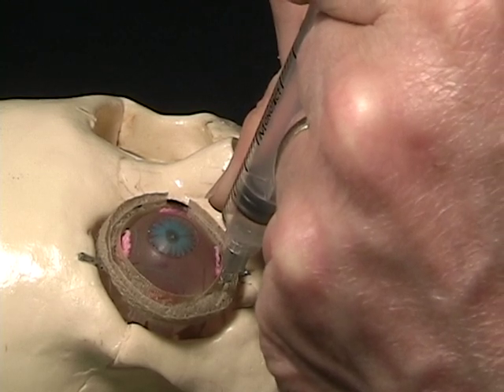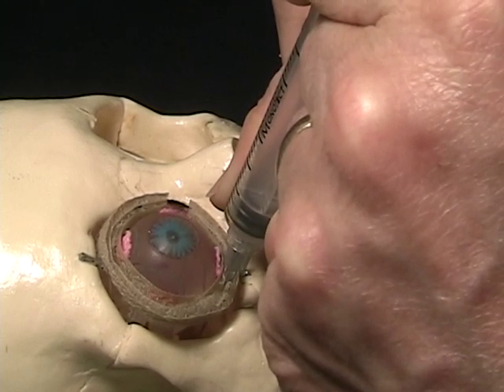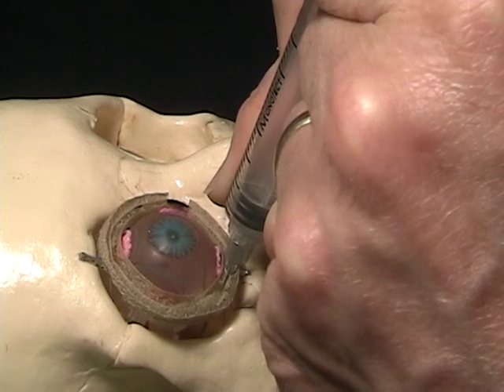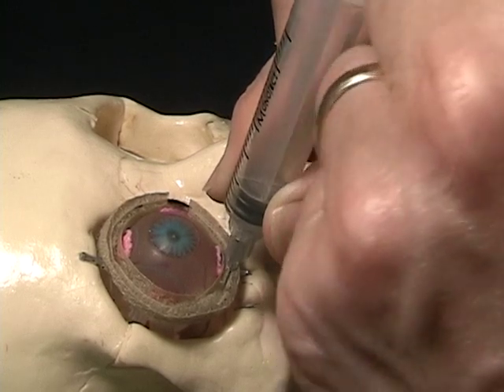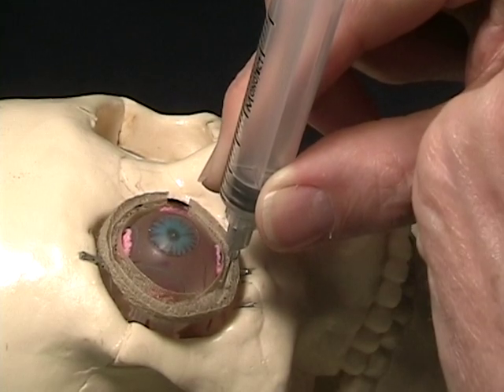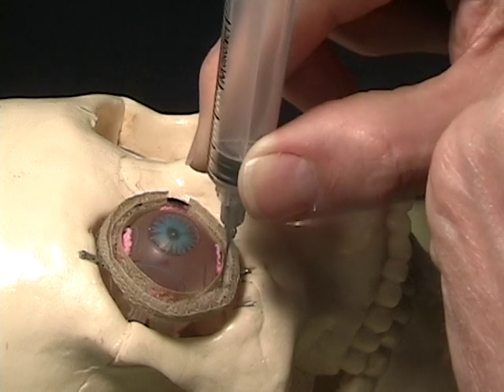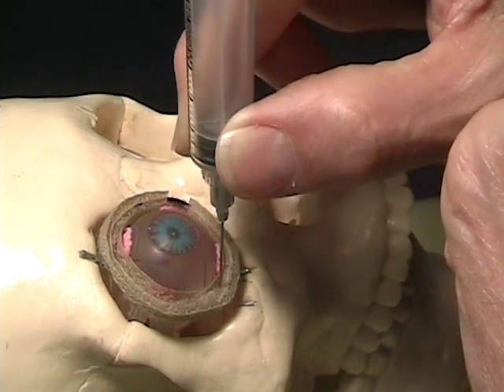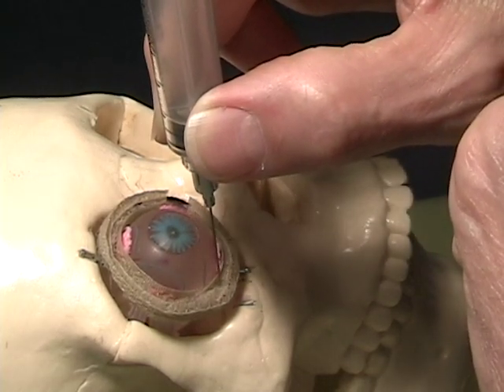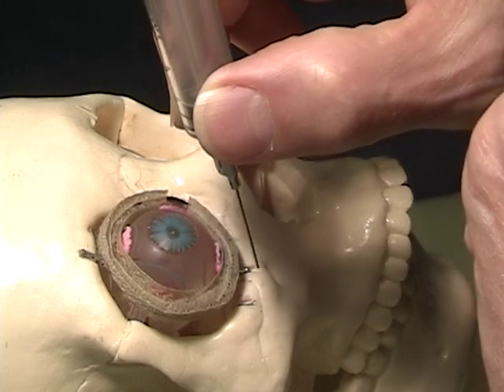As we complete the balance of the injection, we'll then begin to withdraw the needle. We'll come out about a half inch at 90 degrees, and then begin to rotate it towards the orbital floor, withdrawing with the needle at about 120 degrees.